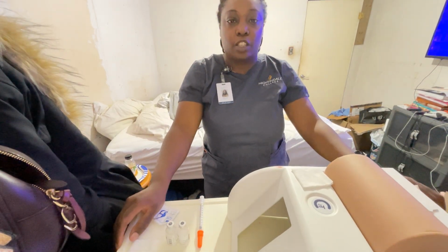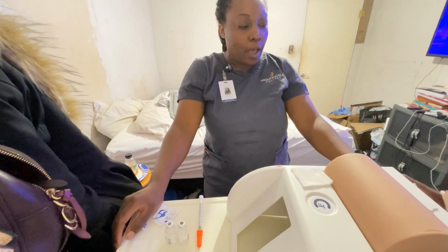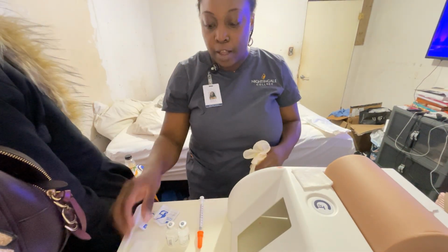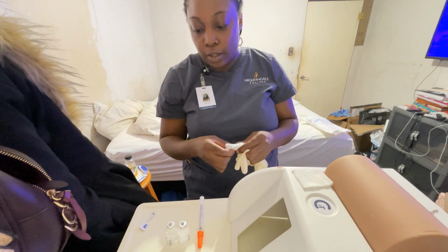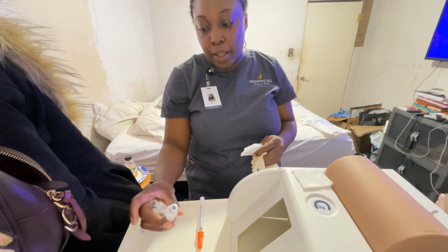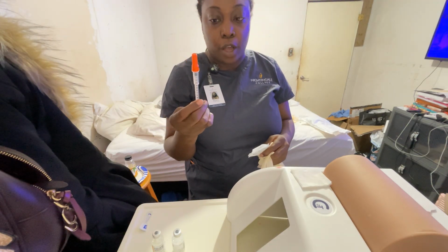Hello, my name is Rakisha Rushing, and I'm going to be demonstrating a skills video, which is to draw up insulin. For my supplies, I have my two working gloves, my alcohol prep pad, a gauze, my regular insulin, and then my NPH insulin. And I also use a 1 milliliter syringe.